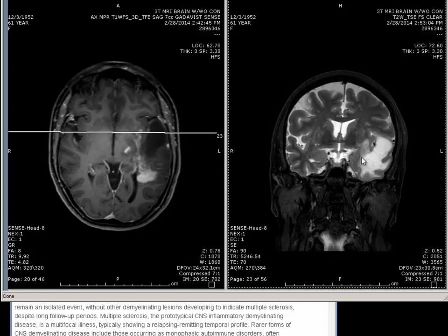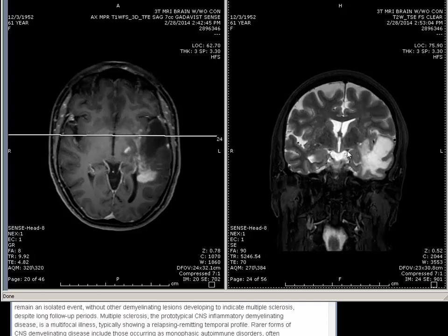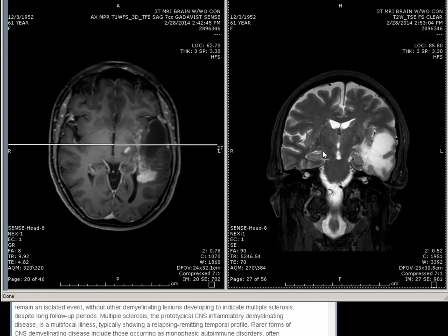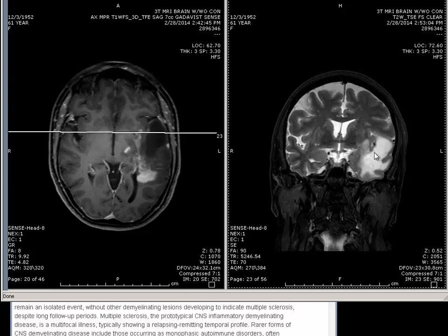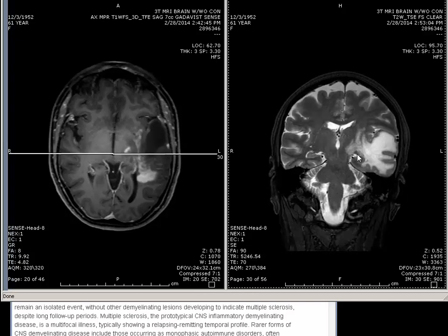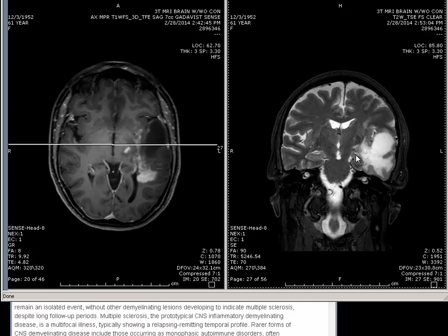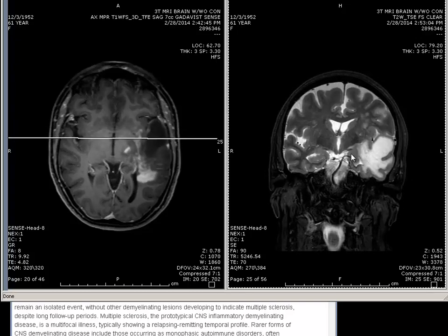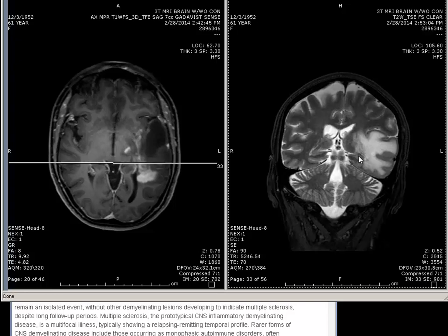The interesting part about this case is you can see the optic nerve, optic chiasm, and optic tract. Usually the optic tract disappears here into the parenchyma of the brain. You don't follow it. But because of the vasogenic edema in this patient, you can follow the left side of the optic tract clearly until it joins the thalamus right here. Follow my arrow. This is the optic tract on the left side. That makes sense with the patient's symptom of right side homonymous hemianopsia. So I will explain that later.